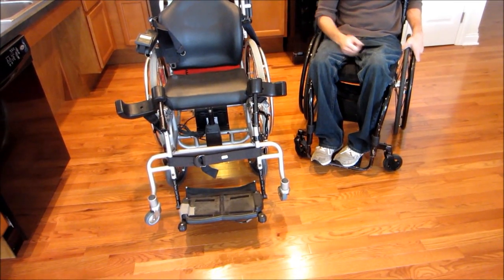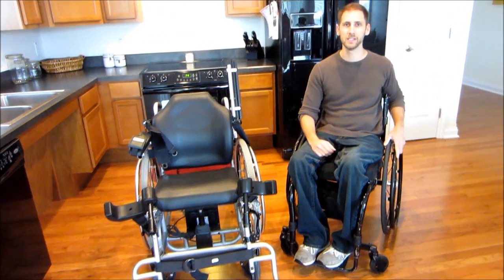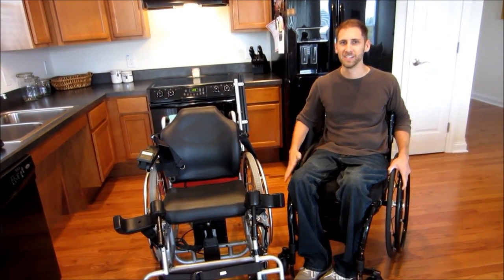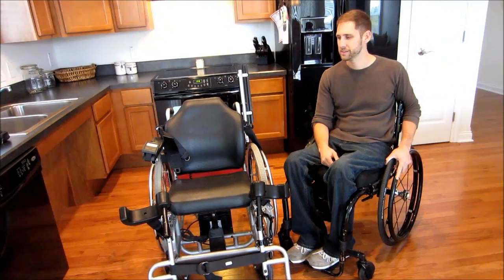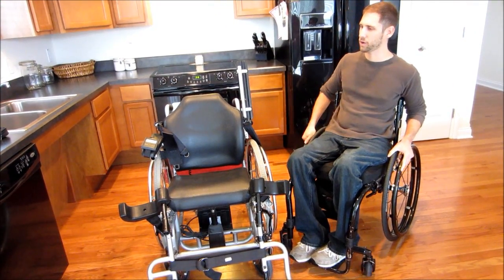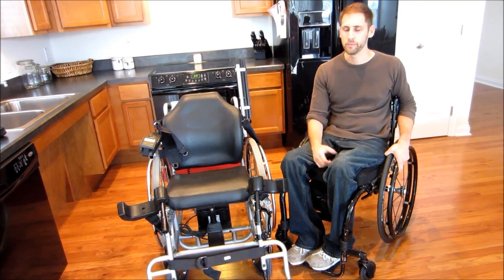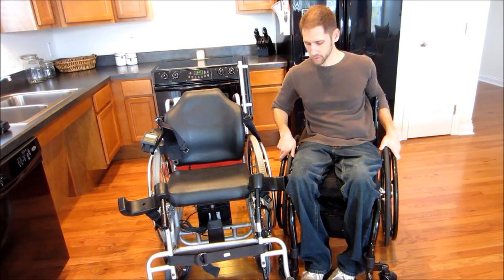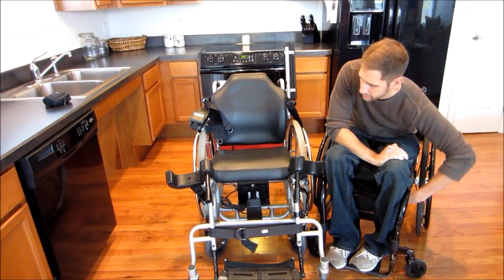Had to replace the battery pack, but I mean, it's big and clunky, but it does what I need it to do. I think this chair weighs about 90 pounds. The chair that I use on a daily basis is only about 35 pounds. So with that said, it's kind of hard to get around, but like I said, it does exactly what I need it to do. To start the transfer, I just get as close to the side of it as I can, and then I'll lock in.